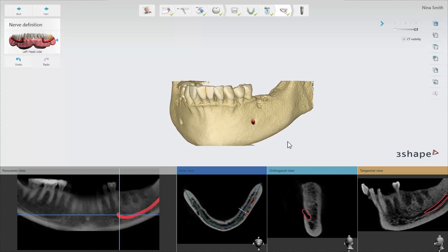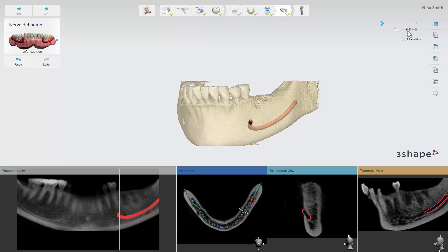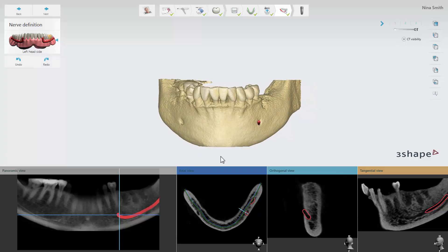You can always check the nerve canal in the 3D view by moving the CT visibility slider to make the bone more or less visible. Once you have defined the nerve canal you can move on to the implant planning step by clicking Next.